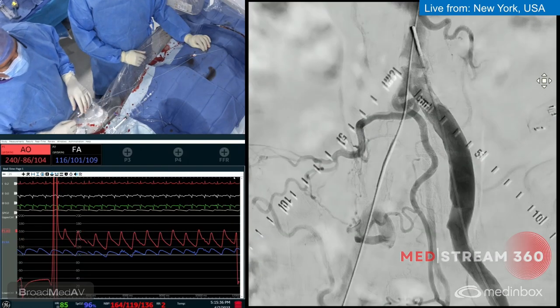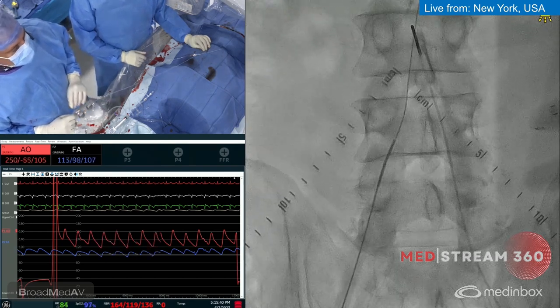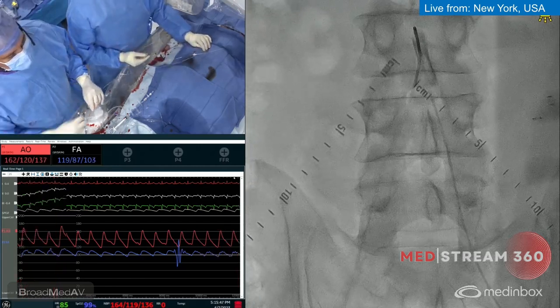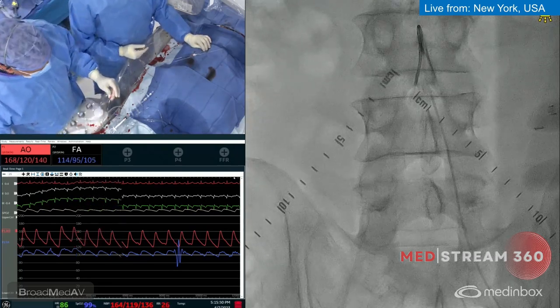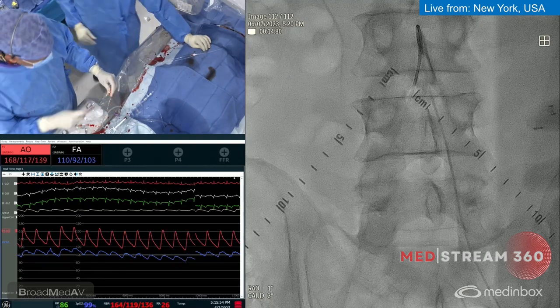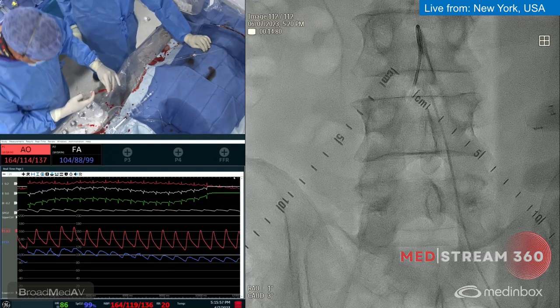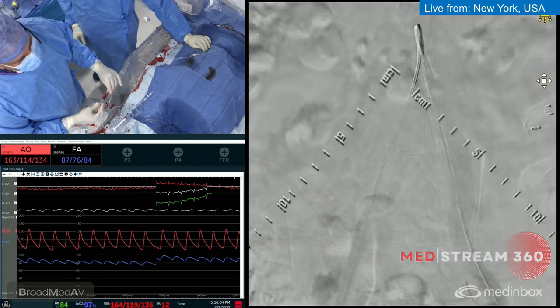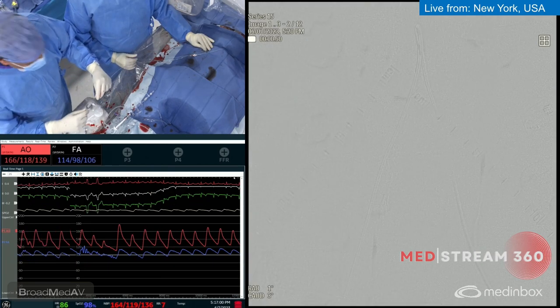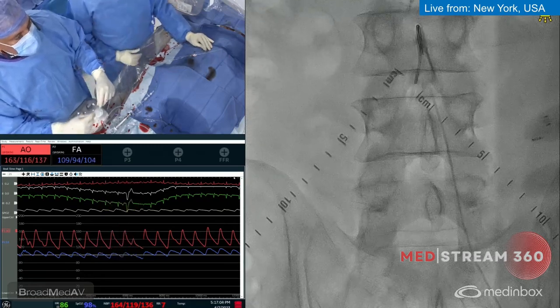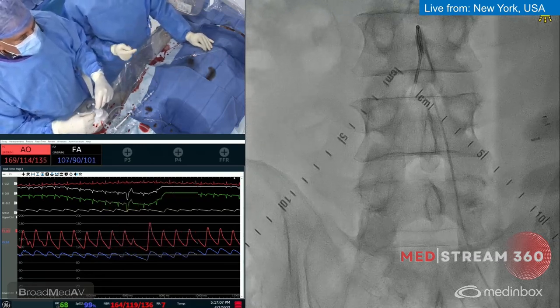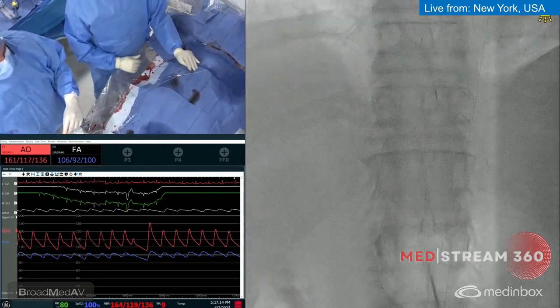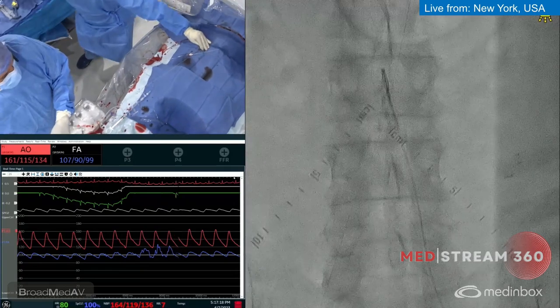We've now crossed — the question is how we crossed, which is the only remaining concern. It looks like we're slightly ipsilateral. We'll check our position and confirm. Regarding antegrade access: if needed, we would use a left radial diagnostic approach — a 5 French catheter with a pigtail down the left radial. That's absolutely a smart idea, and we're more than ready to do that as a bailout if we're unable to cross.